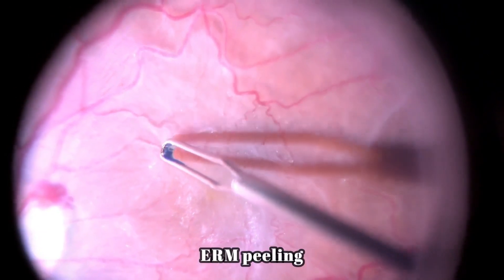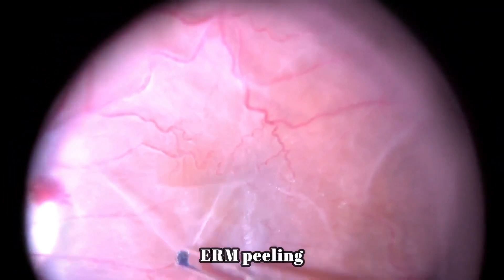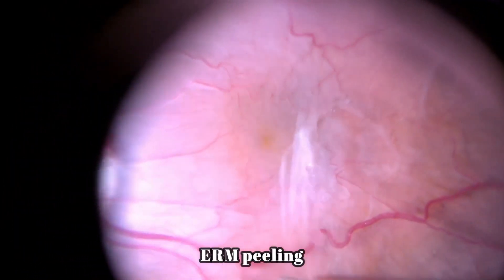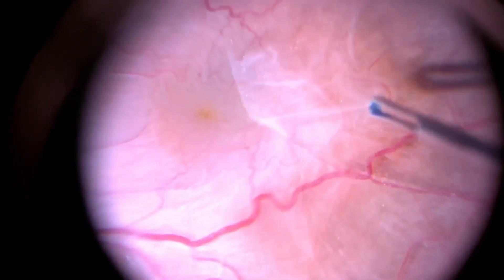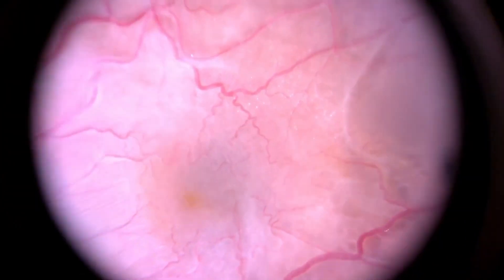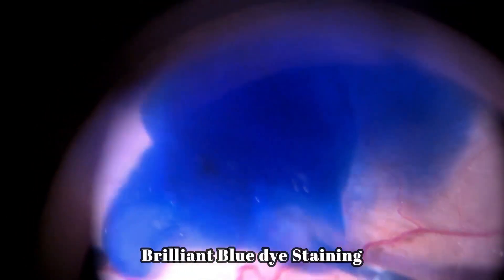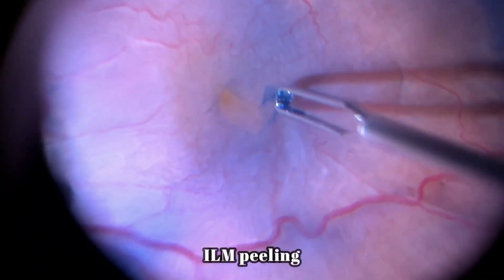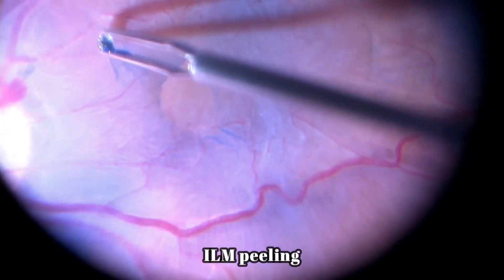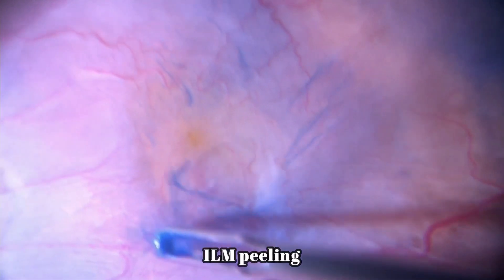After this, a fine forceps is used to peel the epiretinal membrane from the surface of the retina in a circumferential manner so as not to exert any traction. After this, brilliant blue was injected and with the help of that staining, we removed the ILM.